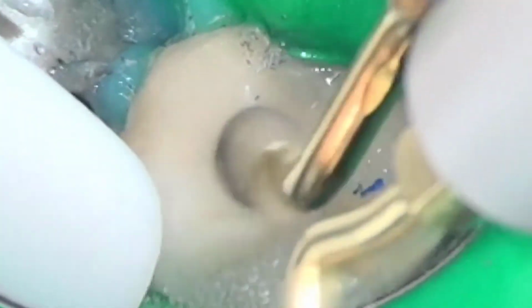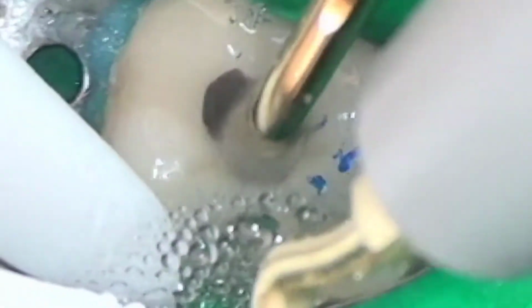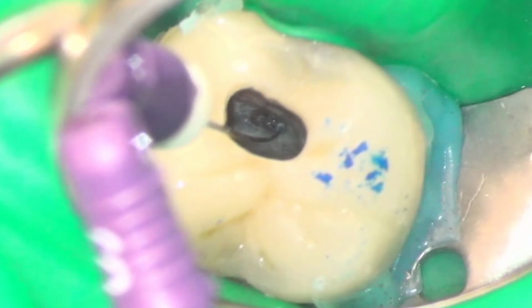A diamond tip ultrasonic unit is then used to trephine between the MB1 and the palatal canals in order to locate the elusive MB2 canal.